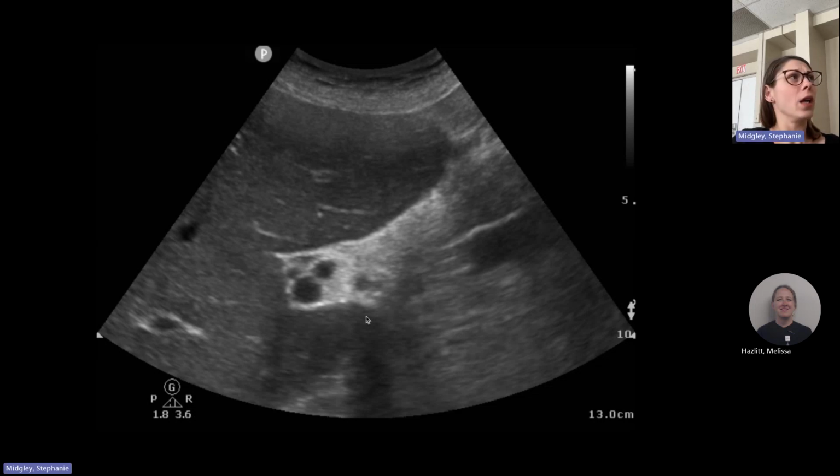Yeah. It was like the wall, the gallbladder, the edge of the wall, every fluid. Yeah, it's a matter of playing with your twist. Yeah. Because you got to get that portal vein in cross section.